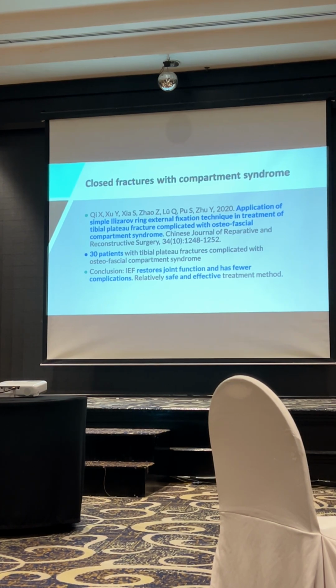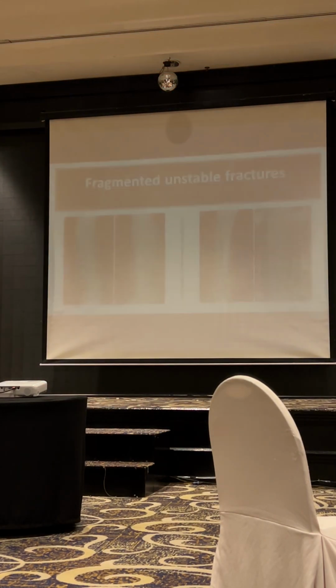So fantastic results. Besides that, another indication for Ilizarov is performing it in a closed fracture with compartment syndrome as well. This paper by Key et al. used Ilizarov for compartment syndrome in 30 patients. Finally they managed to restore the joint function and had fewer complications. So it's a safe and effective method for compartment syndrome as well.